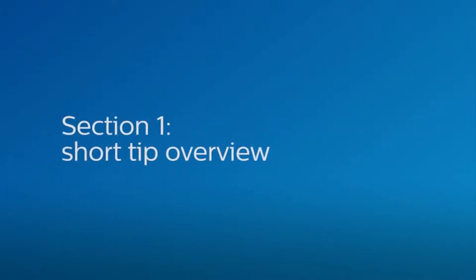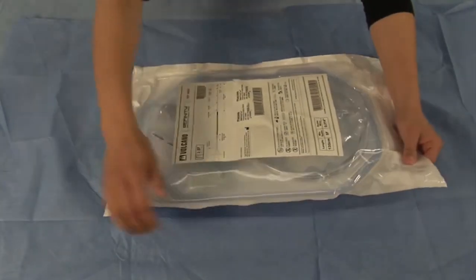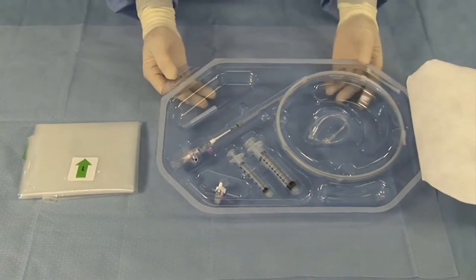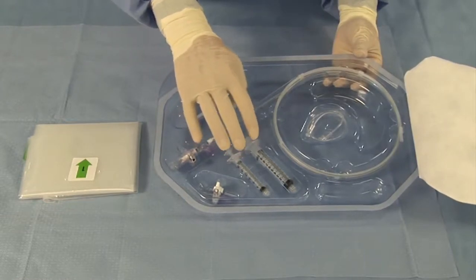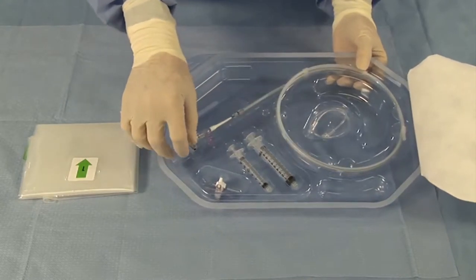Welcome to the Refinity IVUS catheter training video. The equipment needed are the Refinity Rotational IVUS catheter and SpinVision Pullback Device. Carefully inspect the package prior to use for any breach of the sterile barrier or damage to the contents. The package includes a sterile PIM cover, a 3-way stopcock, 3cc and 10cc syringes, a 13-inch extension tubing, and the Refinity Rotational IVUS catheter.